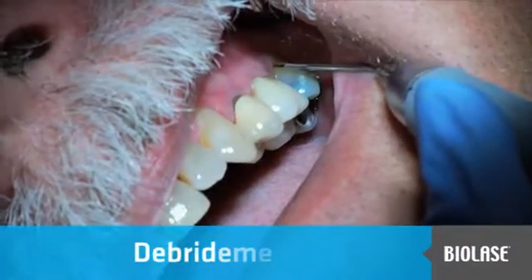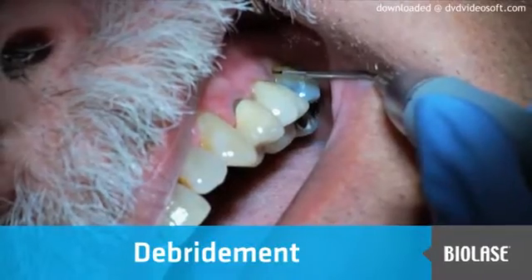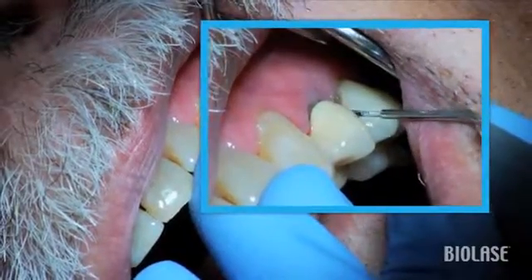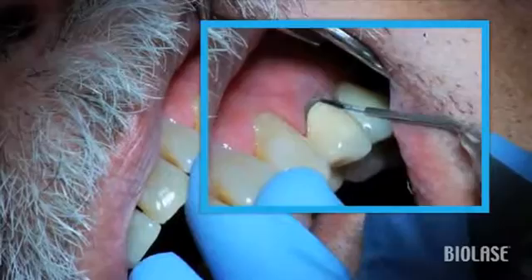For this procedure, Jennifer is using a 400-micron, 7-millimeter perio tip. The EiLase is at the perio pocket preset on the CP2 pulse setting. The tip is initiated. The patient is fully scaled, root-planed, and anesthetized.